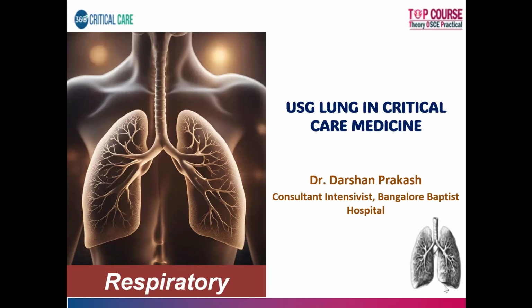So today's talk, I'll be dealing with ultrasound lung in critical care medicine. This is something that we use day in and day out at the bedside, as a routine examination tool in critical care. It is so extensively used that of late the use of the stethoscope has gone out of vogue. It might become a piece of instrument which will be in the museums in the long run if we continue to understand the art of ultrasound.